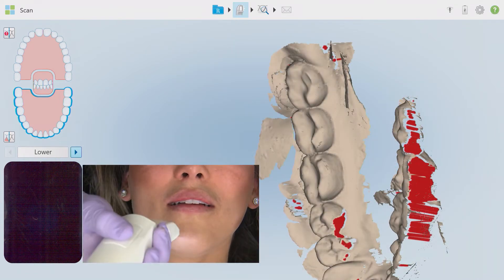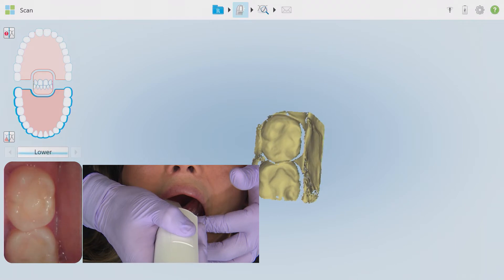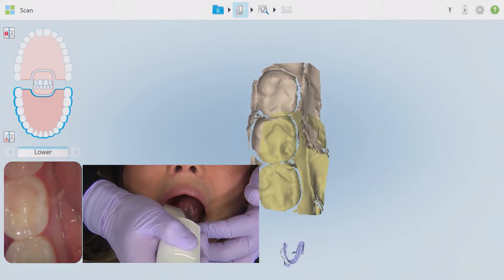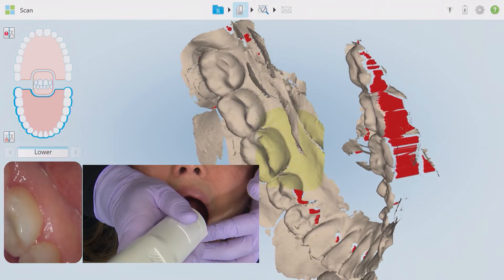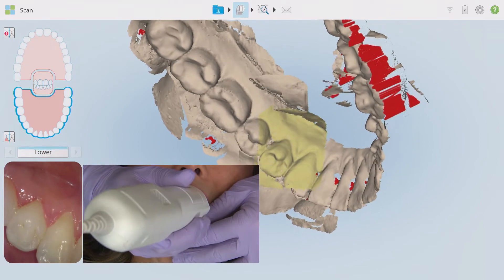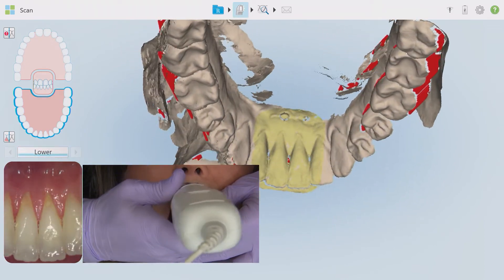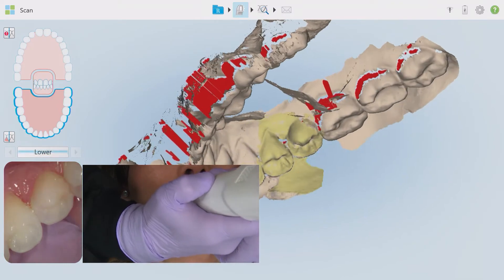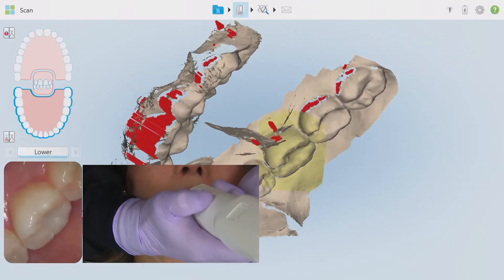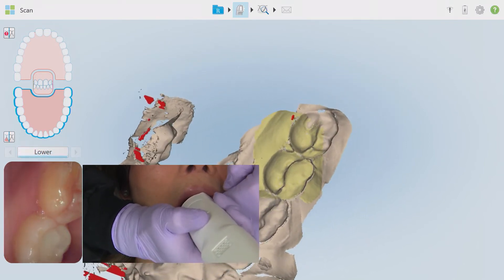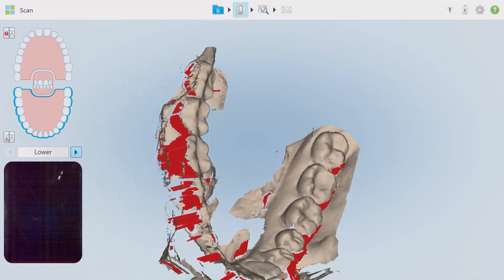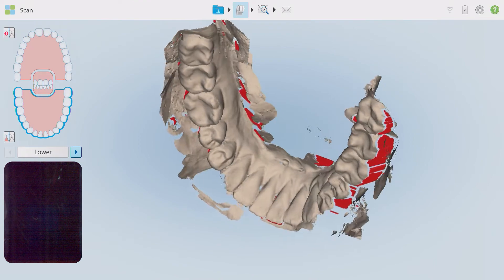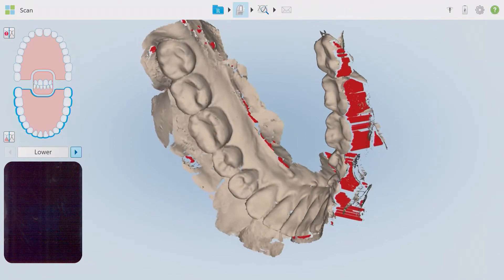So starting once again from the distal of the most posterior tooth on each side, I'm going to scan the lingual next. However, I need the scanner to recognize where I am and pick up the previous scan where I left off. So I'll start on the occlusal surface first, scan for a few seconds, and wait until the old and new data meshes together. Now once the previous scan appears on screen, I can turn the wand to the lingual and start to move it around the arch. I'm most concerned about scanning the embrasures and undercut areas of the lingual now. As you can see, I have turned the wand so it faces almost straight up to the ceiling and I will twist it with both hands if I need to, laterally left and right as I move along this arch. Don't be nervous to make bold movements to capture these hard to reach areas. If there is any advice I can give to enhance your effectiveness during scanning, it's to always make bold and purpose-driven smooth movements. Now that I'm coming around to the distal lingual of the opposite side, I'm going to stop the scan once again and review it to make sure there are no missed spots.